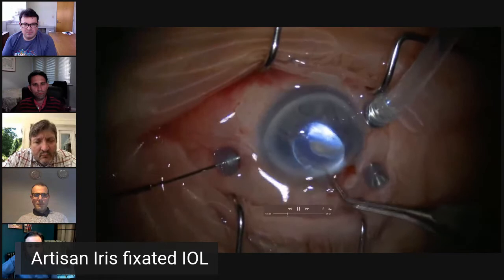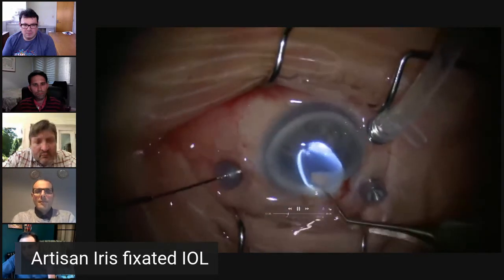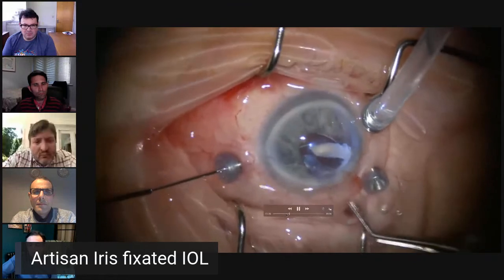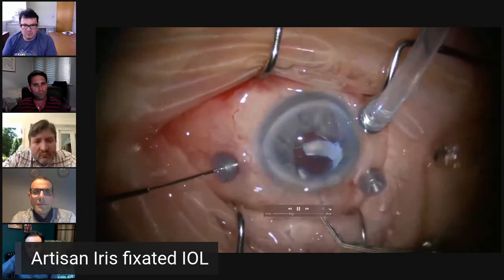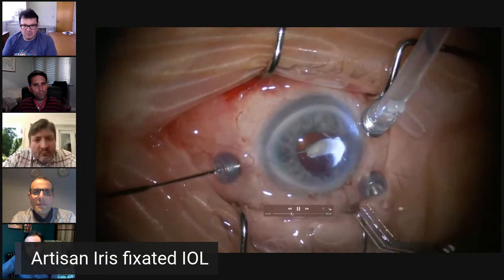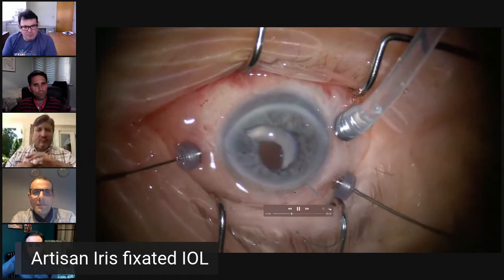Also with the 27 gauge cutter that I use, the EVA machine from DORC, I've used all the 27 gauge cutters, you know, from Alcon, from DORC, and Bausch and Lomb, and I think it's the most efficient one in terms of eating out remnants and even removing lens fragments. So you can see that there is quite a bit of capsule with fibrosis left behind, and it's attached to one of the haptics.